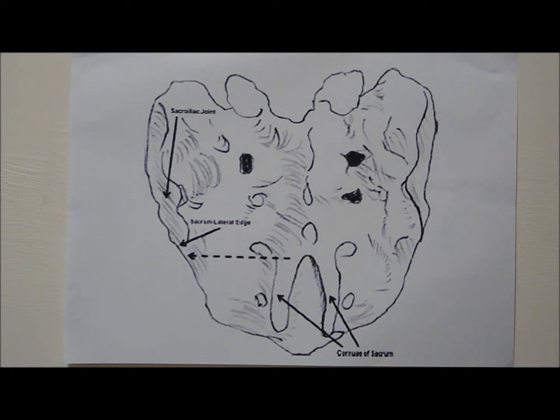Similar to the caudal epidural injection, the patient is placed in a prone position. The transducer is placed in a transverse orientation to identify the sacral hiatus first. After identifying the sacral cornua, the transducer is then moved in a lateral direction until the lateral edge of the sacrum. With the transducer still maintained in the transverse orientation, it is then moved in a cephalad position until the second bony contour of the ilium is identified.